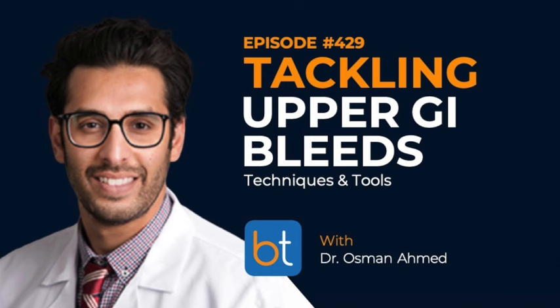And sometimes just getting past that matters. The other thing for the trainees is if you're not well into that celiac trunk, you can bounce out with that injection pretty easily. And so that's where, especially with the CT checking it out, you think, maybe I should get some more purchase and actually get into that common hepatic if there is narrowing in that celiac trunk. You know what I mean?